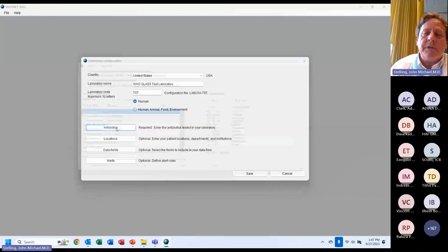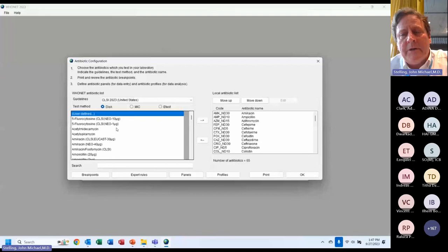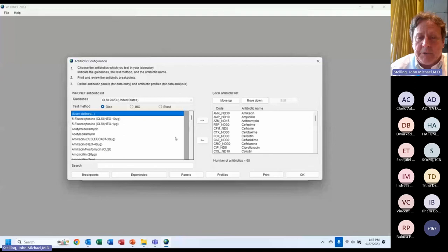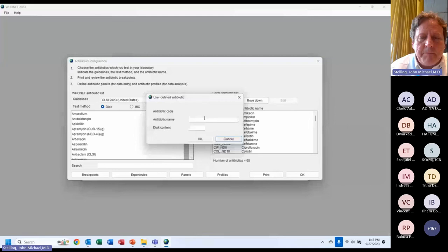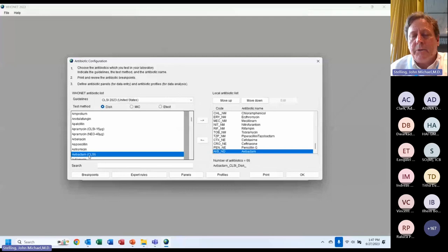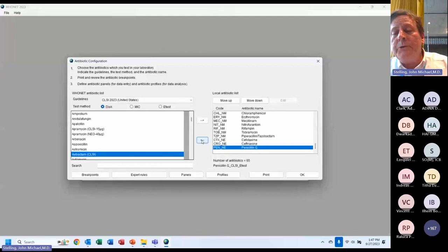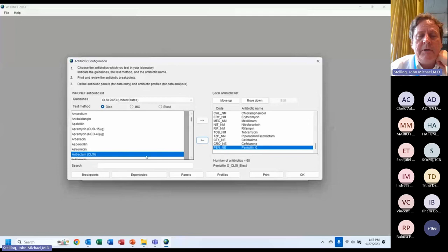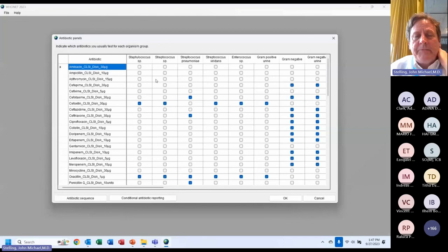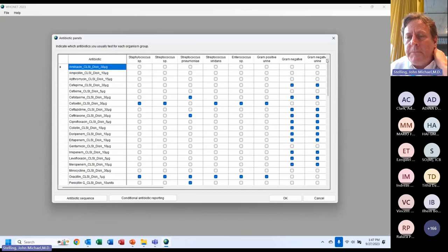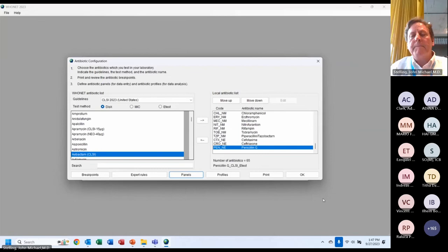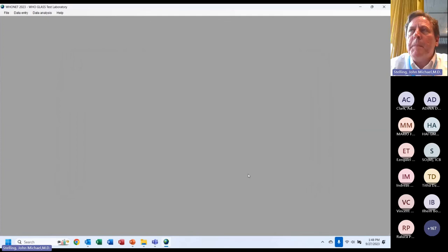When clicking on 'Antibiotics,' you see the GLASS antibiotics on the right — we have predefined which antibiotics WHO is asking about, and you can add more. Under 'Panels,' you see for Staphylococcus these are the GLASS drugs requested in blue, then Gram-negative organisms, then Enterococcus. So the value of these predefined templates is that we have already done the work. You do not need to create a GLASS lab to use GLASS — any WHO Net configuration can be used to create a GLASS export. GLASS is not a question of data entry; it's the export.